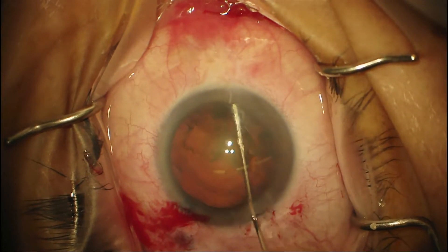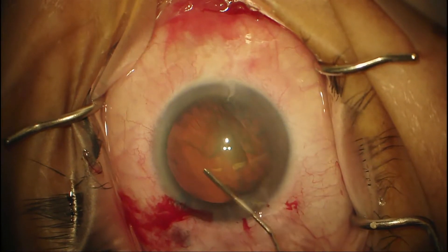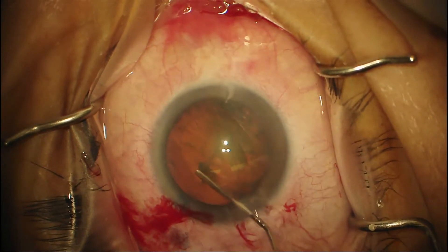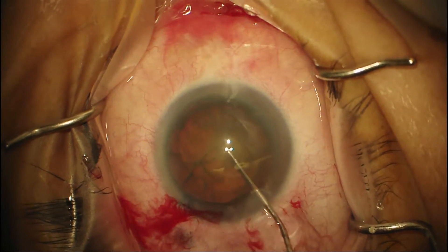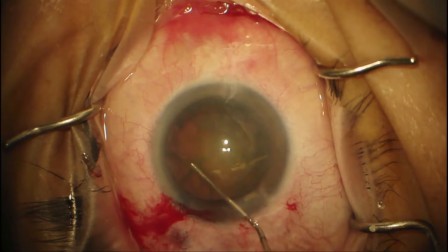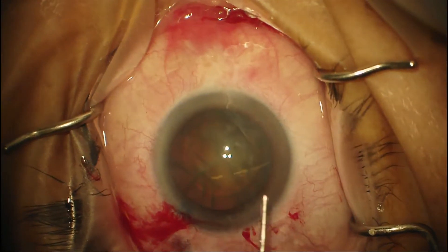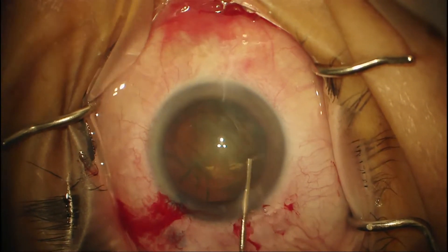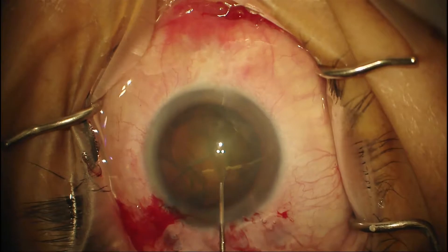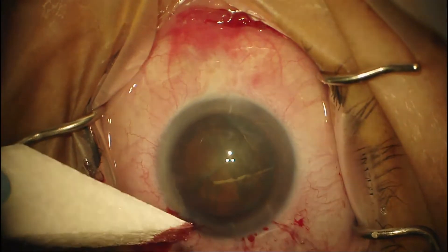There you can see some viscoelastic come out of the eye and the lens come up — that tells you you've got some fluid around there. But I didn't see a fluid wave, so I keep pushing. On these dense cataracts, sometimes you don't see a fluid wave. It's always good to verify prior to continuing with the phaco that you can rotate the nucleus. I would keep doing hydrodissection and blotting down the pressure until you can confirm that you can rotate the nucleus — that's the safest way for a beginning phaco surgeon.